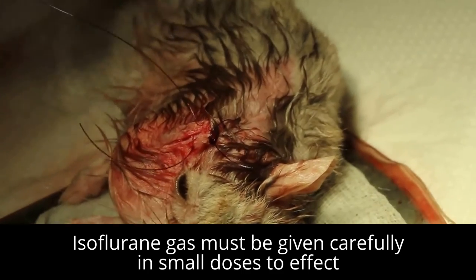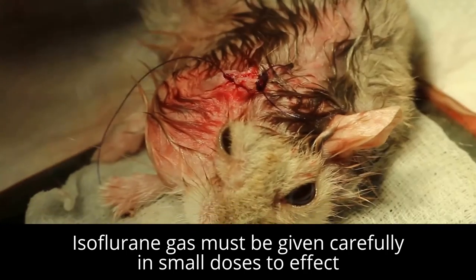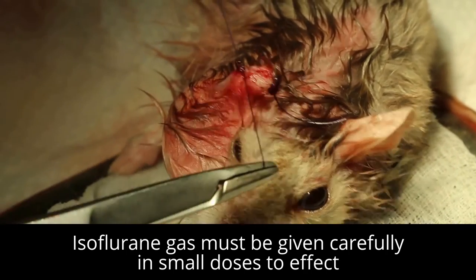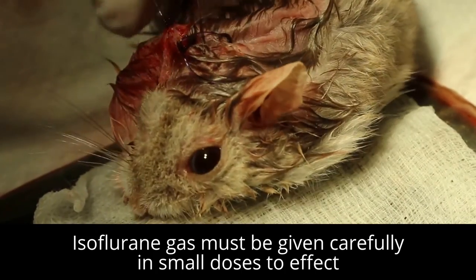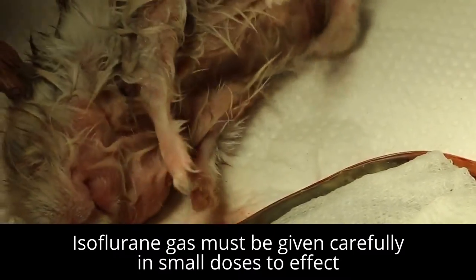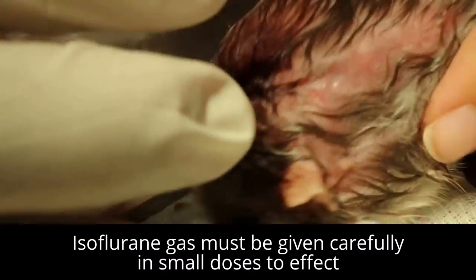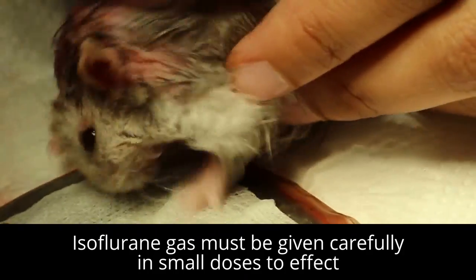Afterwards, we will clean up the blood, but we can do it now better, but if not, maybe we'll wait. You're gonna wake up soon, yeah. These stitches will dissolve. Okay, finish. Just try and clear the blood without being bitten. Then where is the container? You forgot the green container.